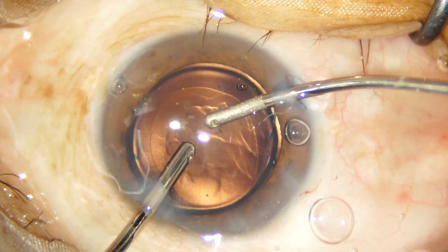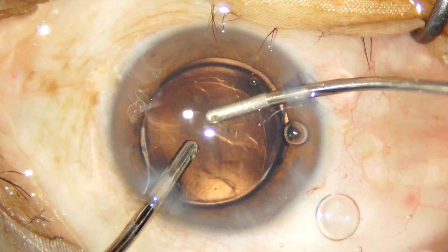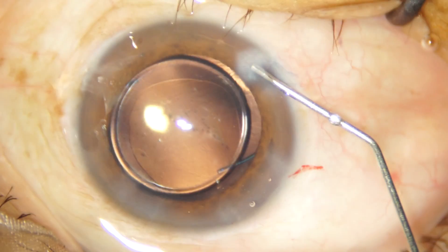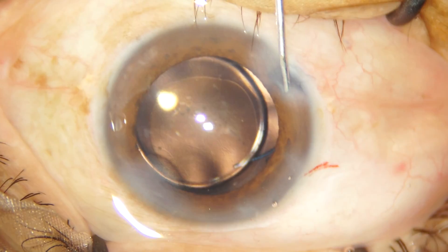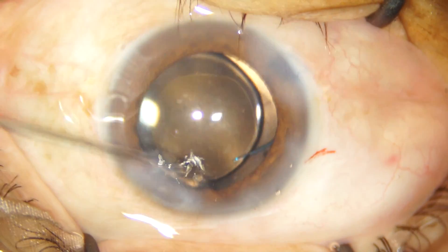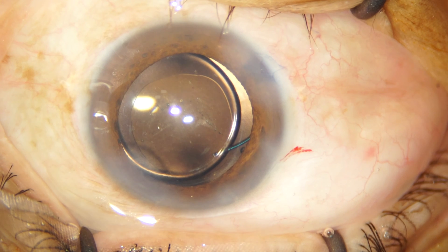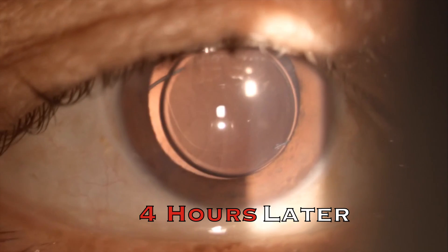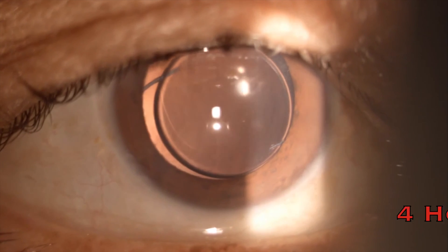Once the IOL is in the bag, we now remove all the cohesive viscoelastic from the anterior chamber, the wounds are hydrated, and this concludes the case. I was very honored and humbled that a very dear old friend considered me worthy enough to operate on his father's eye.